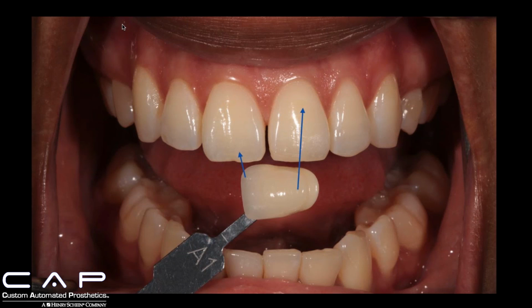And what this does is it allows your eyes to move less. It's less of a workout for your eyes. You don't have to look way up to the gingival portion and then all the way down to the shade tab, and then the same with the incisal portion. It's right there. It's close, and quite frankly, it works. I've been doing this for a few years, and recognizing a shade is much easier as well.